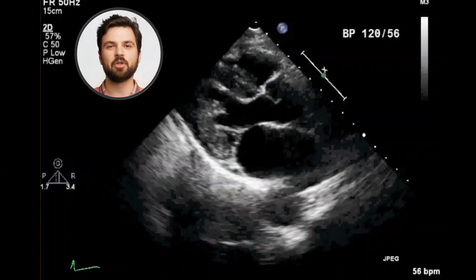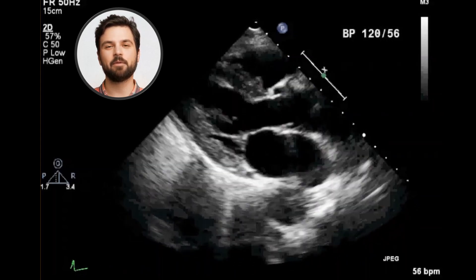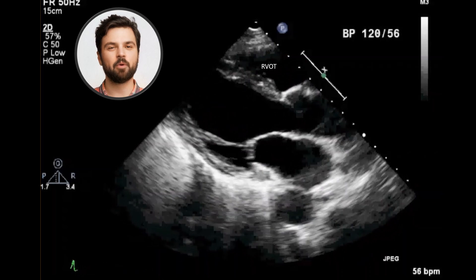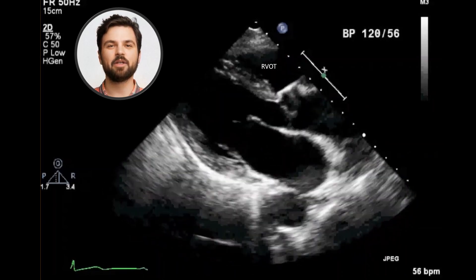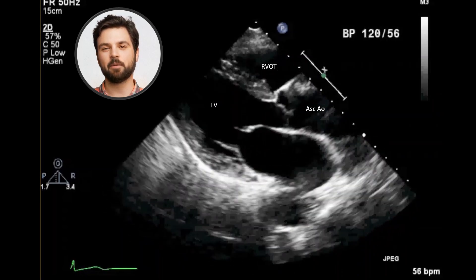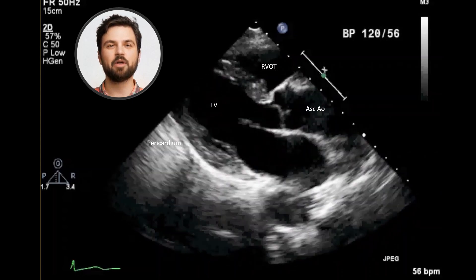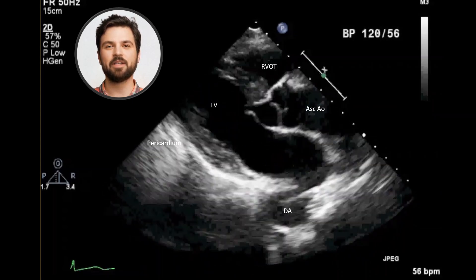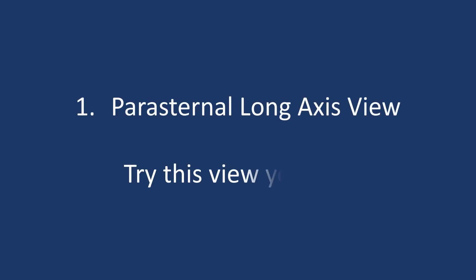In the parasternal long axis view, we also see the mitral valve and aortic valve. Only the right ventricular outflow tract is seen. The left ventricle is seen in its long axis. The proximal ascending aorta is visible, and the pericardium is seen as an echogenic bright line surrounding the heart. The descending thoracic aorta is seen posterior to the left atrium.